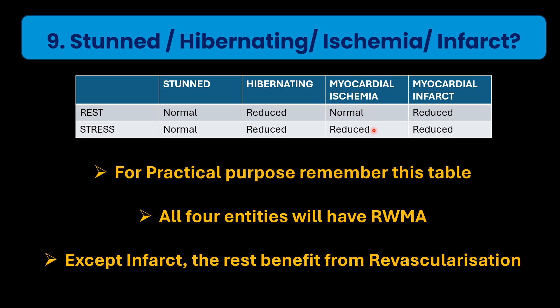In our patient, we saw two areas: in the mid segments, perfusion defects were picked up only on stress — those were areas of myocardial ischemia. At the apex, defects were seen on both rest and stress — that is basically an infarcted area corresponding to the LGE images. So the same patient can have areas of myocardial ischemia picked up only on stress perfusion, and myocardial infarct picked up on stress images.